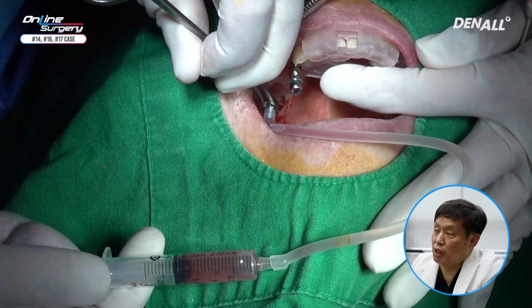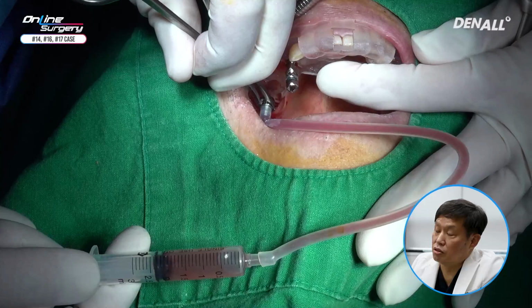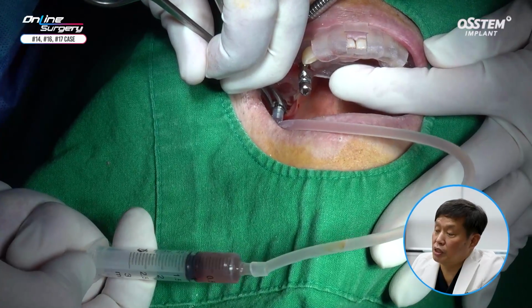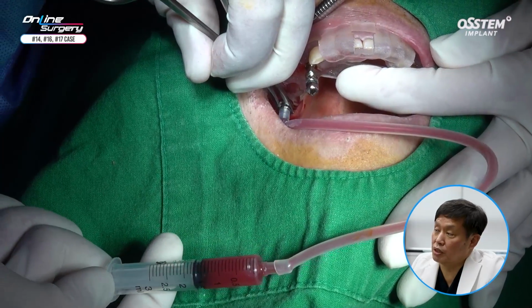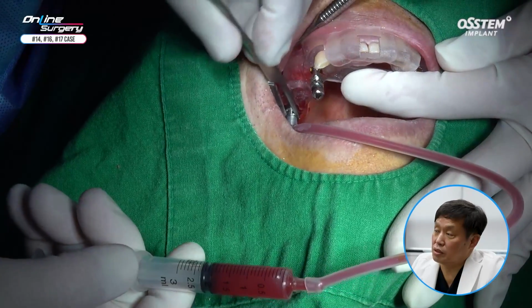In 3 cc syringe, you can see that upon aspiration, there's a blood regurgitation and negative pressure, so you can indirectly check whether there's any sinus membrane damage. Because there's negative pressure, you can confirm that there's a sinus membrane elevation.